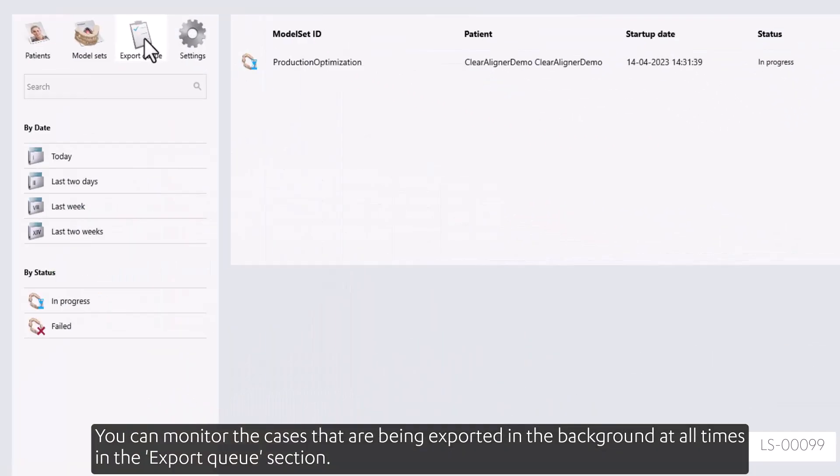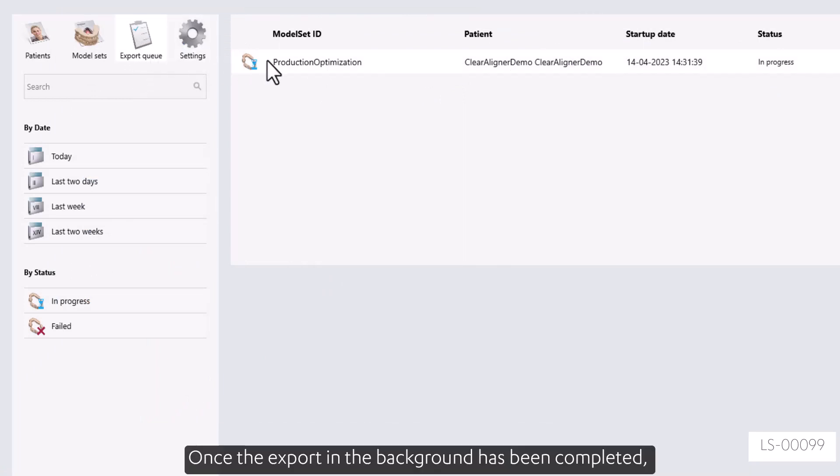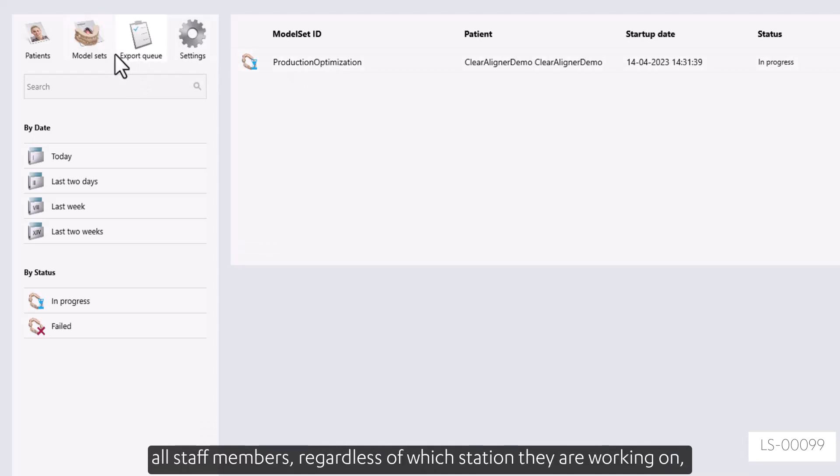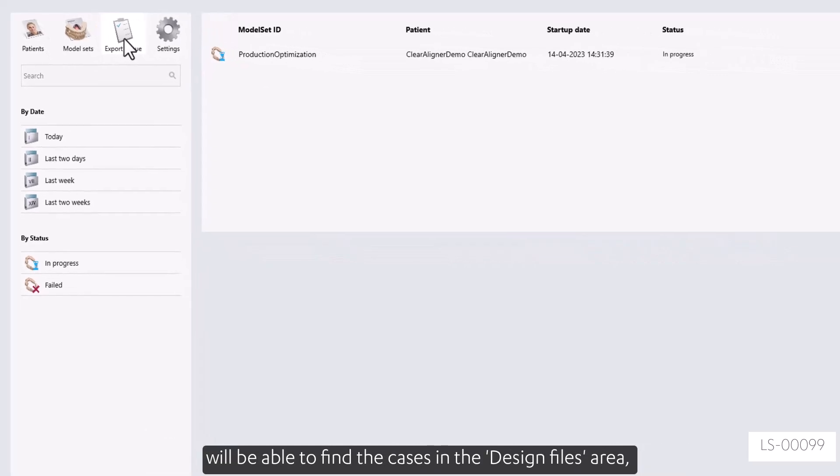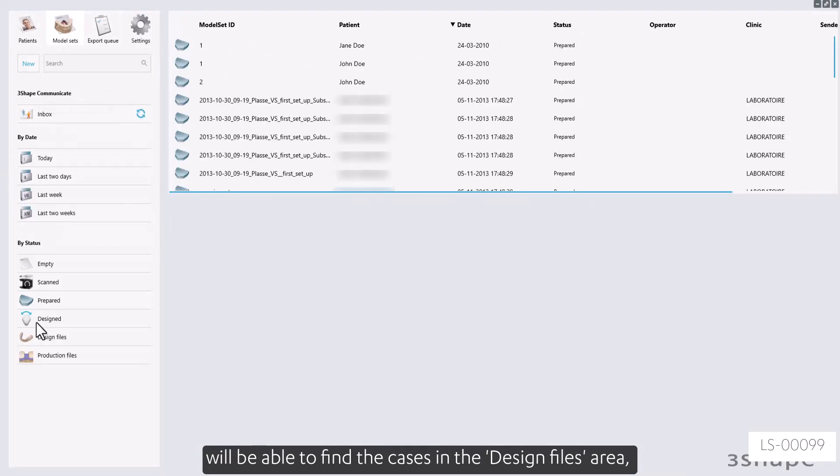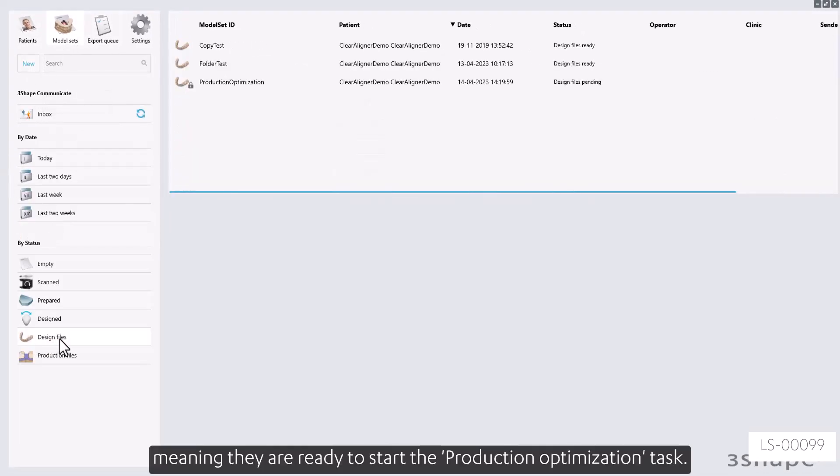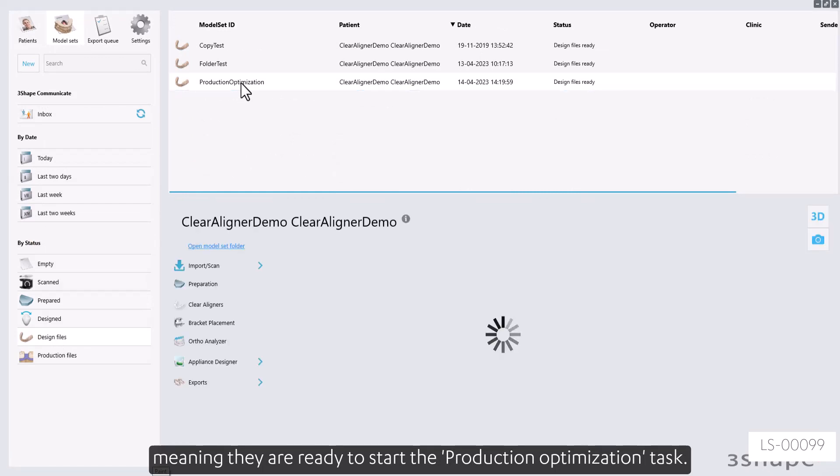You can monitor the cases that are being exported in the background at all times in the export queue section. Once the export in the background has been completed, all staff members, regardless of which station they are working on, will be able to find the cases in the design files area, meaning they are ready to start the production optimization task.